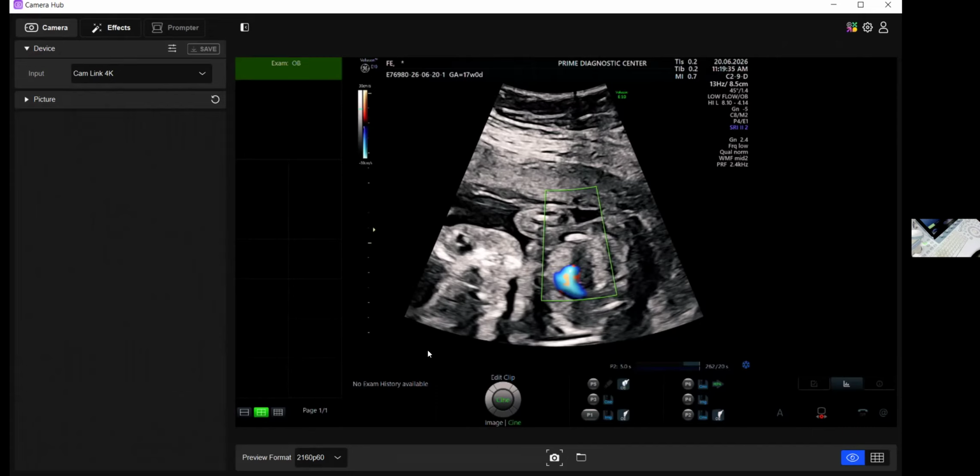Any questions, guys, so far? We'll attempt the thymus in most of the patients, and then we see it. I have a distinct advantage of level 2 scans being done here. Anything, beta?